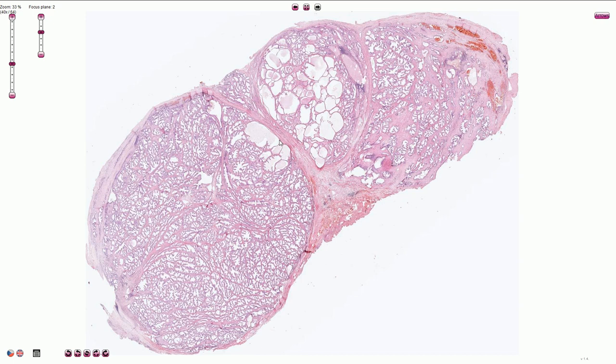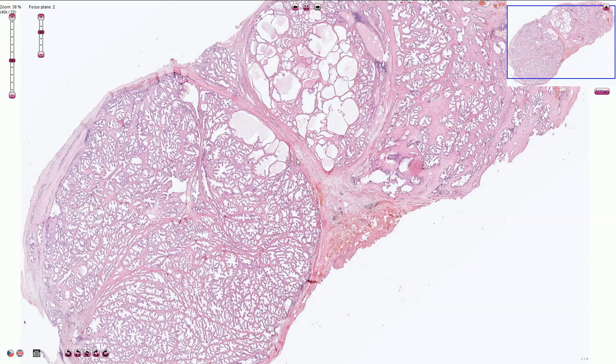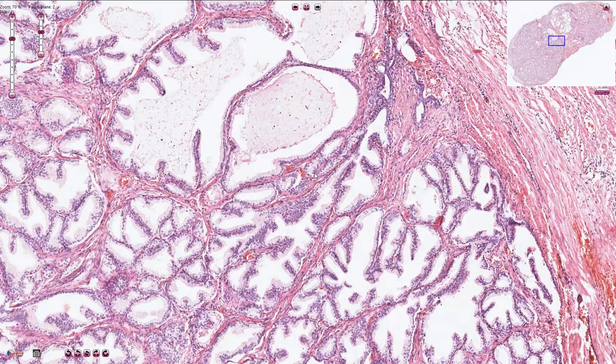Microscopically we can see the nodular transformation of the parenchyma and the hyperplasia of both the stromal component and the acinar component. The acini are hyperplastic with the formation of infoldings or papillary-like structures, and in between the acini we see hyperplasia of the stroma, which consists of both fibrous tissue and smooth muscle cells.